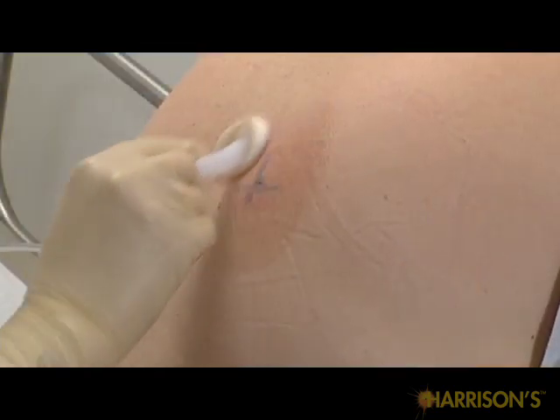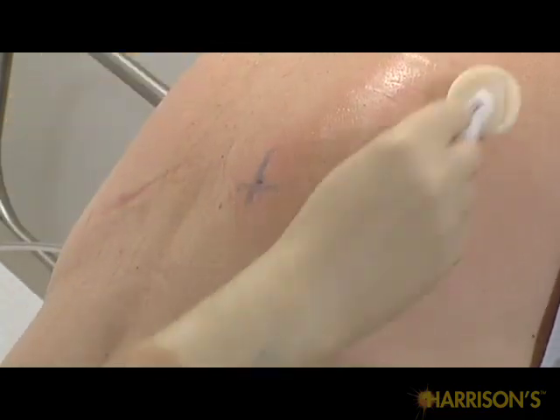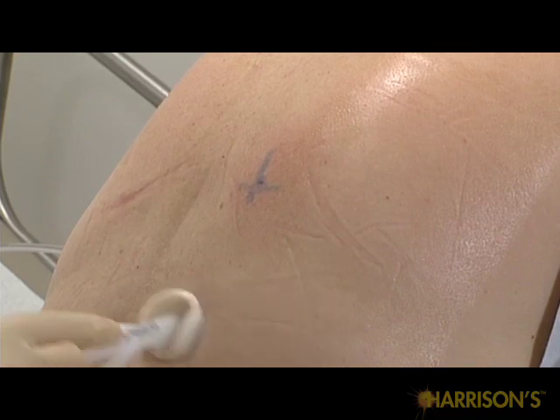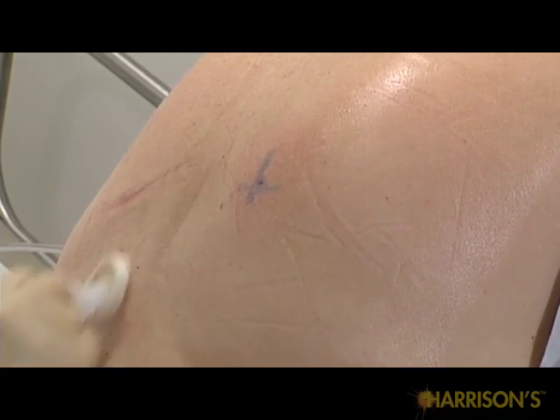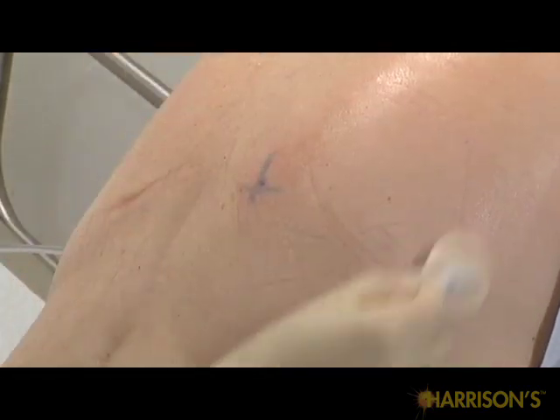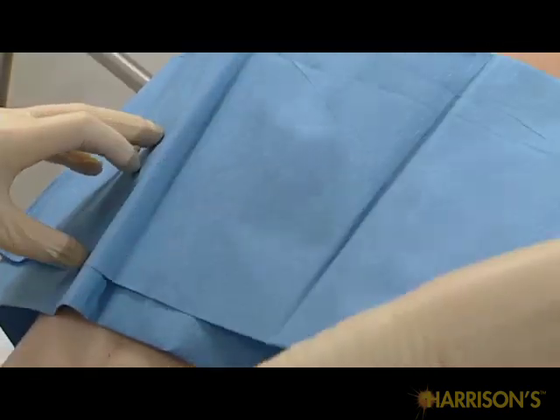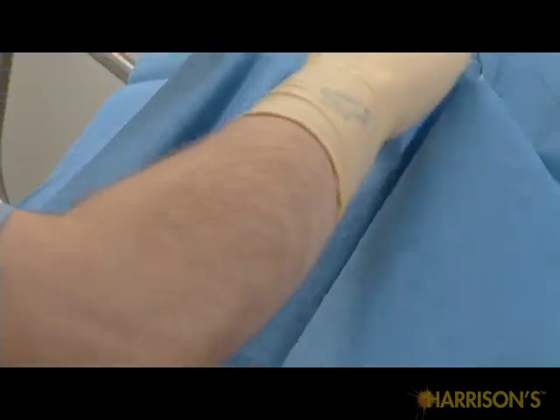Prepare your own sterile field and put on your gloves using sterile technique. Use the sterile prep solution to clean the site you intend to drain, as well as all surrounding skin, including at least the ipsilateral hemithorax and the spine, which can be used as a landmark. Place a sterile drape with a hole or sterile towels around your planned site of puncture. It is helpful to keep landmarks, such as the spine, in the field.